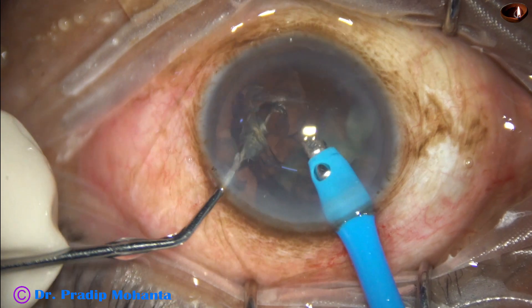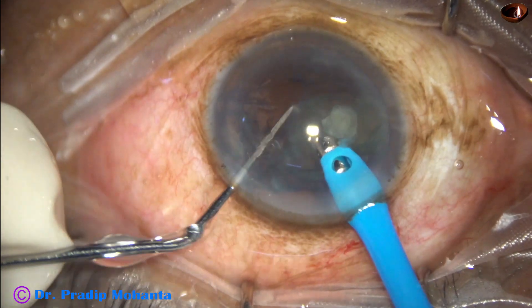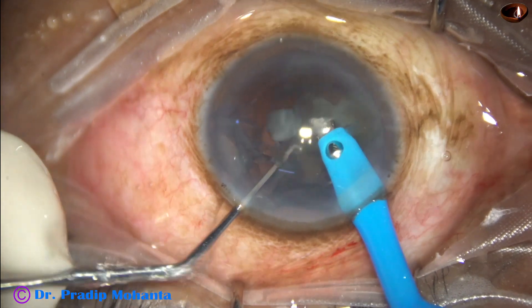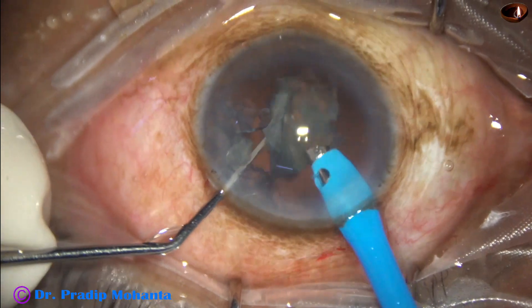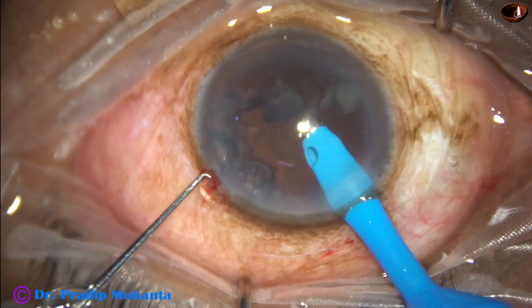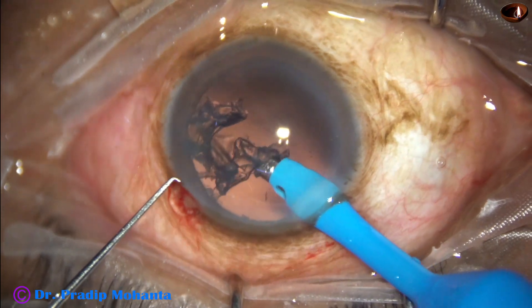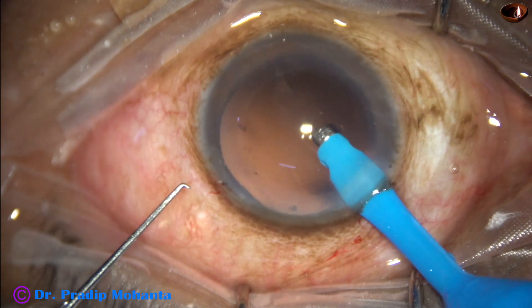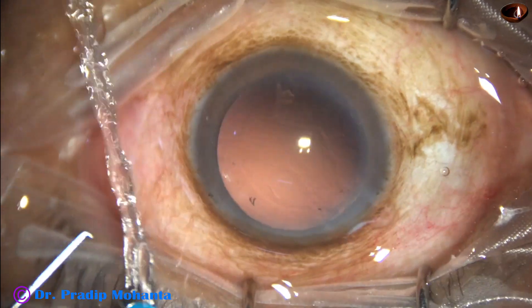This is the last nuclear piece; during this time the parameters are reduced — flow rate 30, vacuum 300 mmHg. We find that the cortex is very minimal and most of the cortex has come out.